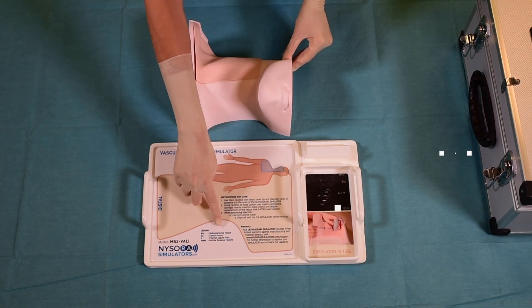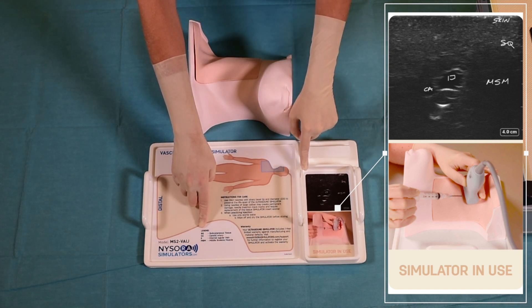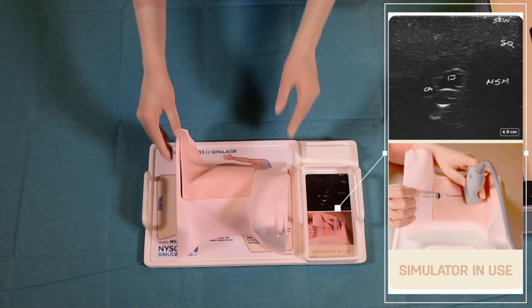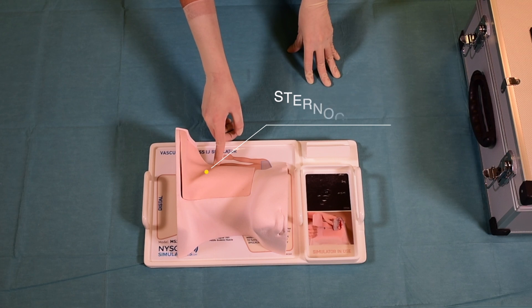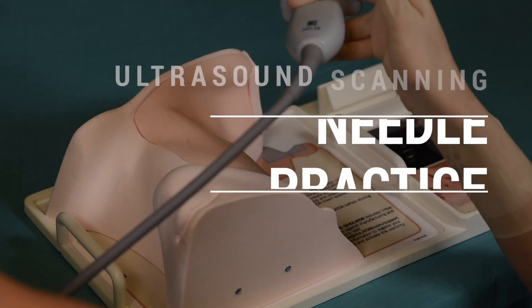All anatomical landmarks and abbreviations featured are printed on the label that accompanies the tray. The tray also contains the ultrasound image obtained from the Nysora simulator, showing reliable anatomical landmarks such as the sternocleidomastoid muscle and the posterior triangle of the neck. To begin practicing, place the simulator onto the tray.